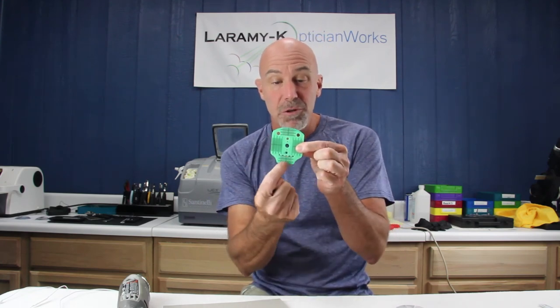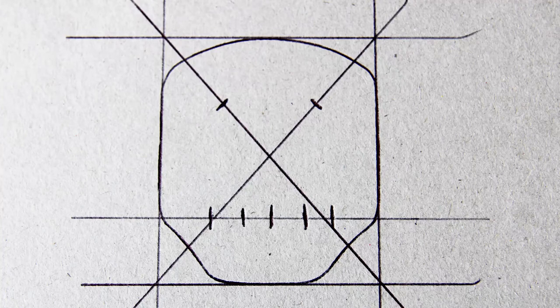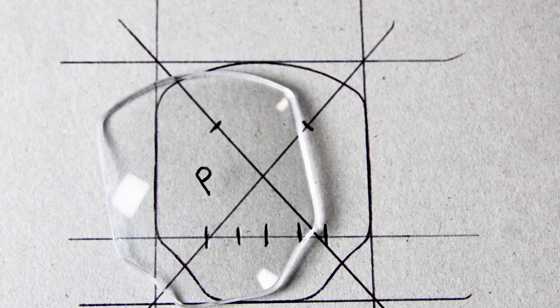In fact, if you've noticed my original holes that I drilled, once I had to make this smaller so that it worked in the edger, they don't line up anymore. So what do I have to do? I had to create another template. So that's what I'm going to do now. I'm going to take these lenses, put them over my template, and drill a bunch of holes in them.